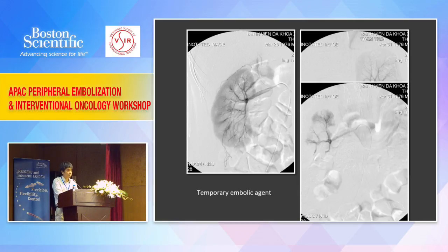The bleeding is stopped. And we perform the Doppler ultrasound to check if the renal artery is recanalized, and if the tension of the patient is controllable. And some days after the procedure, everything goes normal. The bleeding is stopped, and the arterial tension became normal.